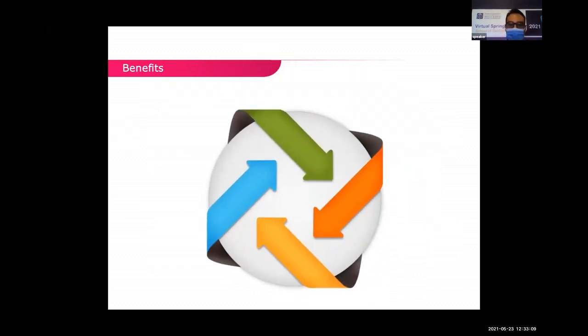The other advantage of digital implantology is that mostly, not always, but usually our surgeries are done flapless, so the blood in the oral cavity is lower than in the traditional way of implant placement. So the patient is more comfortable with this procedure, and the dental assistant needs to turn the suction lower in the oral cavity. So minimum noise will be in the patient's mouth, and also the operation time will be reduced.